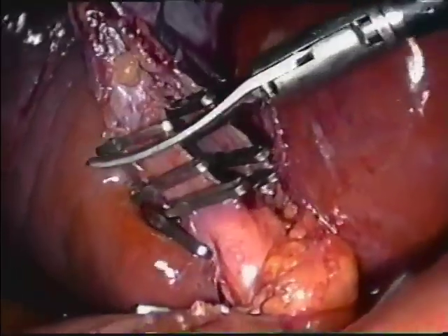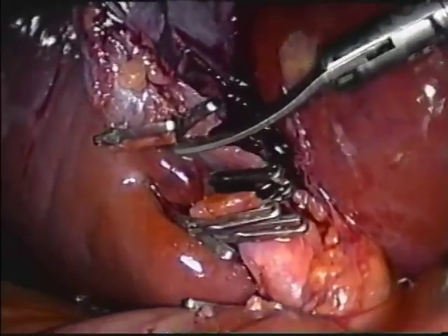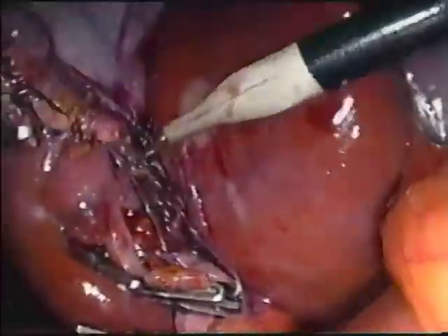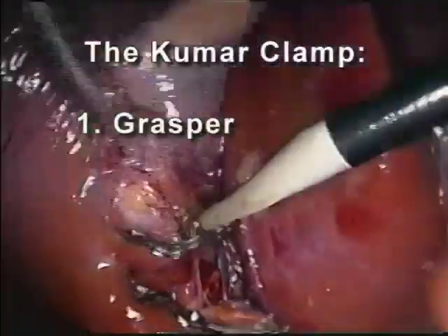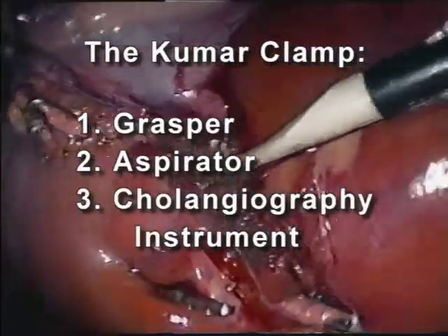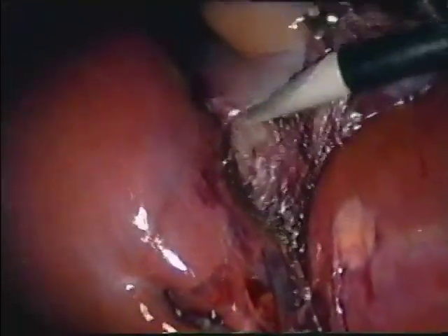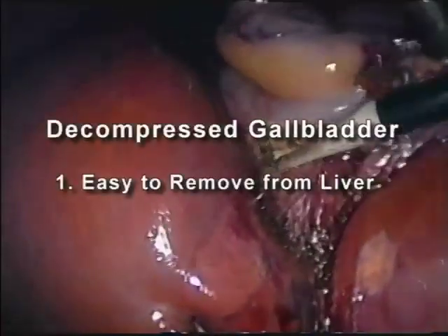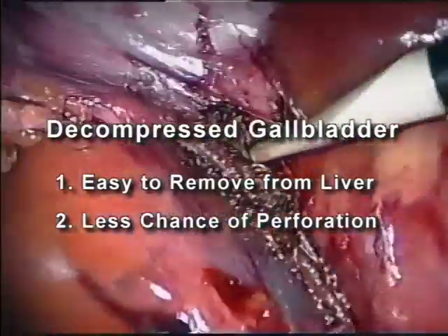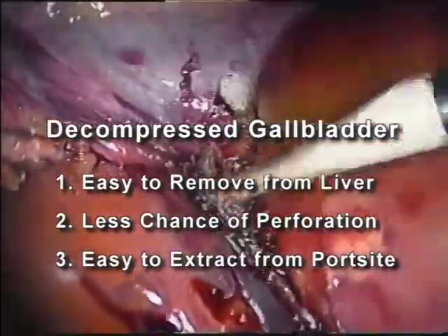The clamp can again be used as a grasper to complete the operation. It is not necessary to switch to different instruments for different parts of the same operation. The Kumar clamp functions as a grasper, an aspirator, and a cholangiography instrument. Since the gallbladder has been aspirated and decompressed, it is much easier to remove from the liver bed. Perforation of the gallbladder is less likely and extraction from the port site will also be much easier.